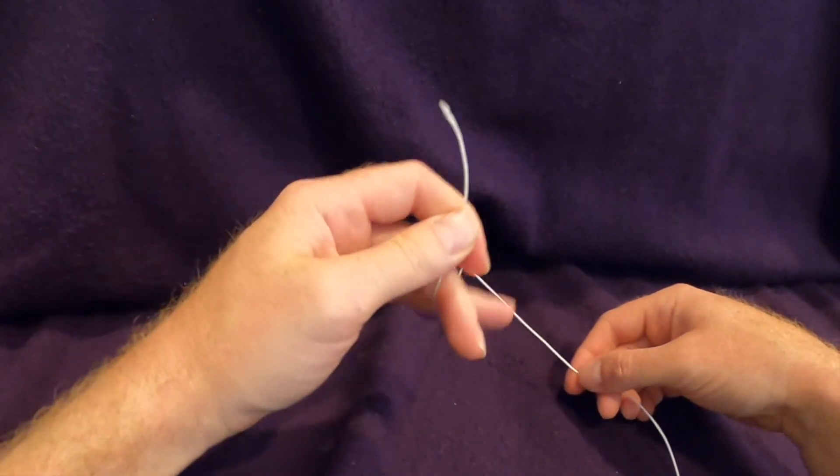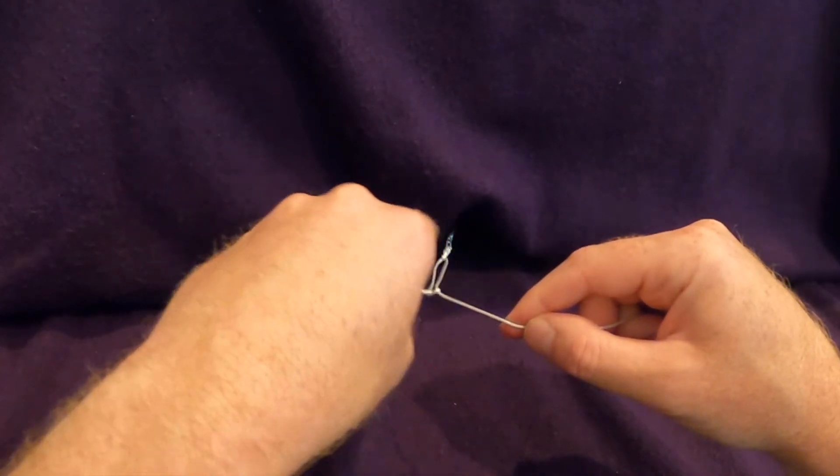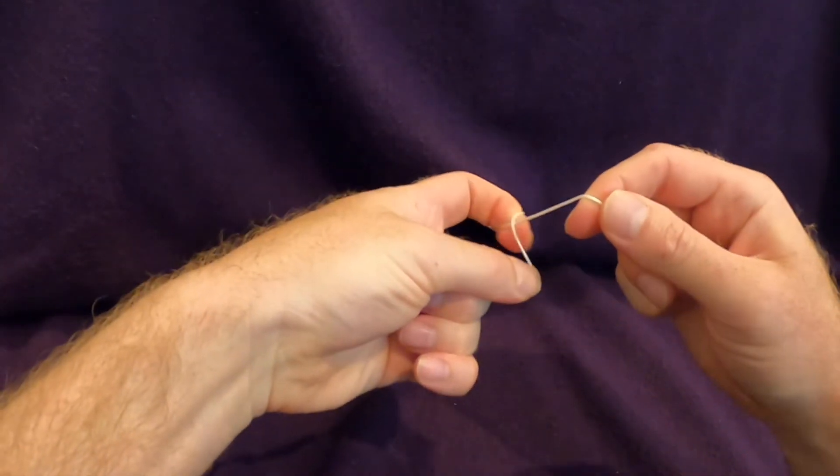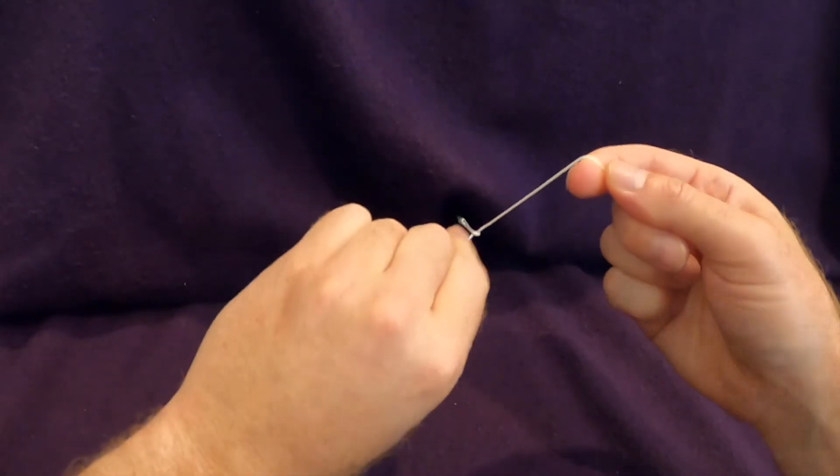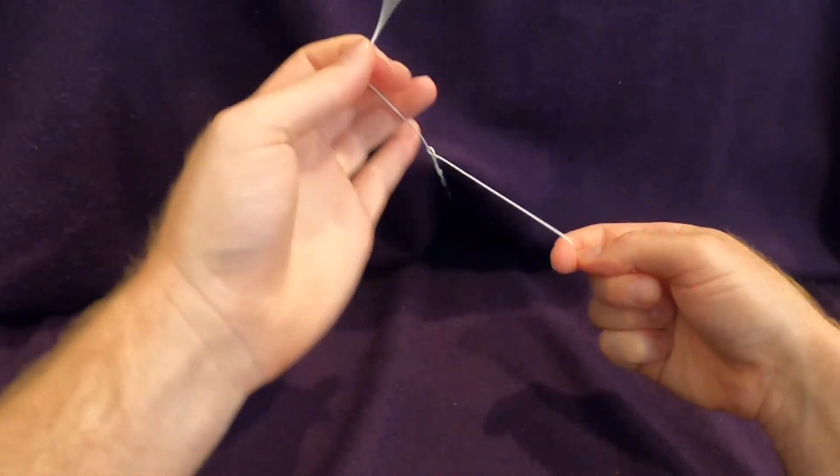Left handed knots are essentially the same thing except the roles of the hands are reversed. This is just one variation of the one hand technique. There are many other different ways to do this and it's important to practice on a shoelace or string before trying this in the operating room.